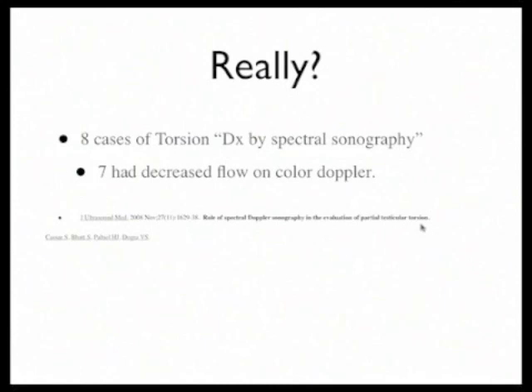So to be honest, I'm not really sure exactly how important this spectral Doppler thing is. I don't know how much it adds to our evaluation. I just couldn't find those studies. It's recommended by those people that we talked about earlier, Blavis and Straczynski, who write the chapters on this. They all talk about it and they all recommend it, and so I'm sure it definitely adds something to the evaluation, but I'm just not sure how much. Unfortunately, I couldn't actually find that information to give to you.